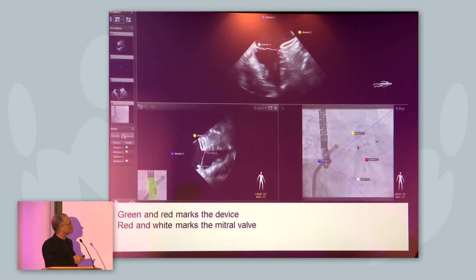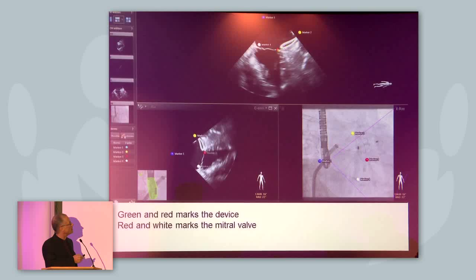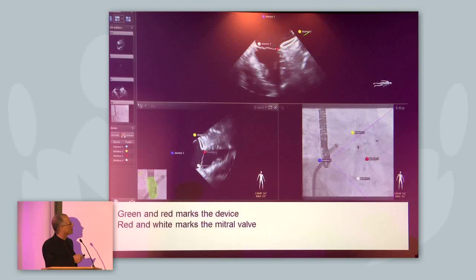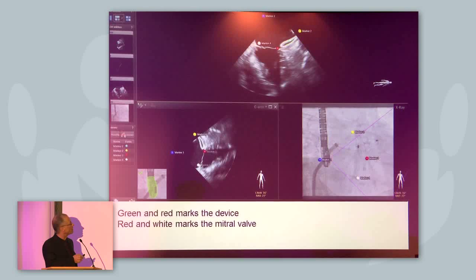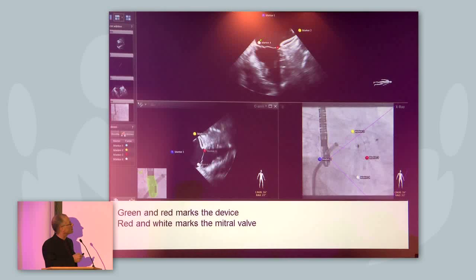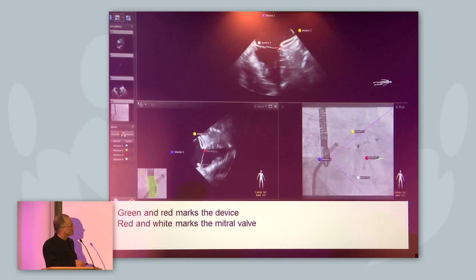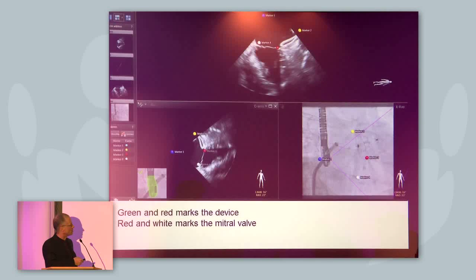Finally, the position of the occluder. You can see that we marked the edges of the umbrella of the LA occluder. This is a mark at the mitral valve, and you can see that this corresponds to the echo images.